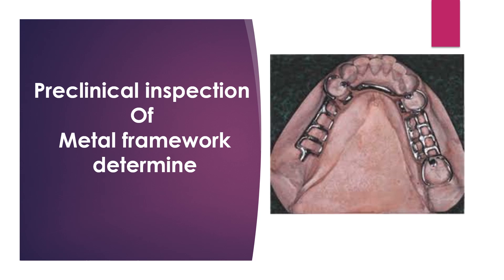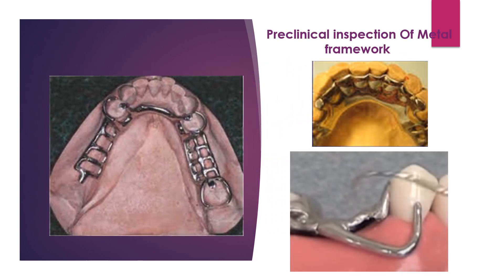Once you receive the framework from the technician, you must be sure it fits accurately on the cast, because in most cases it won't fit directly for the patient. You must confirm it is the same design that was sent. The framework should be highly polished without pits, scratches, or any roughness.